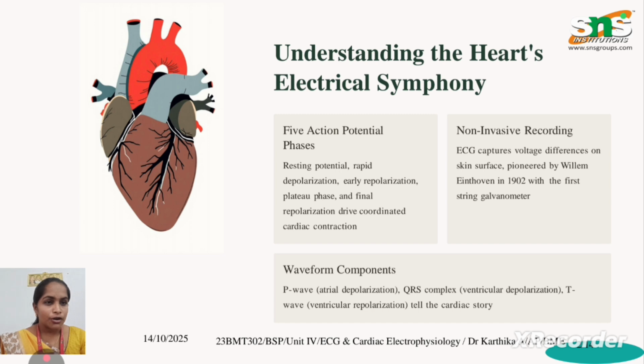Here, in this non-invasive recording, ECG captures the voltage differences on the skin surface, which was formerly described by Willem Einthoven in 1902. Here, the main thing is we have to illustrate the waveform components. Here we have the P wave, QRS complex, and T wave, which tell the cardiac activity story.